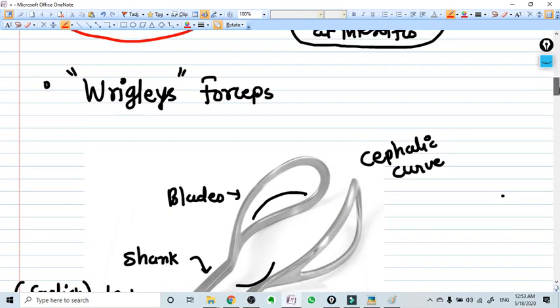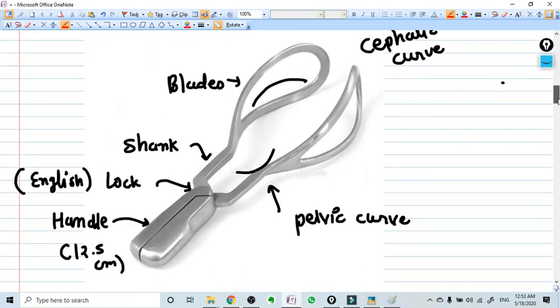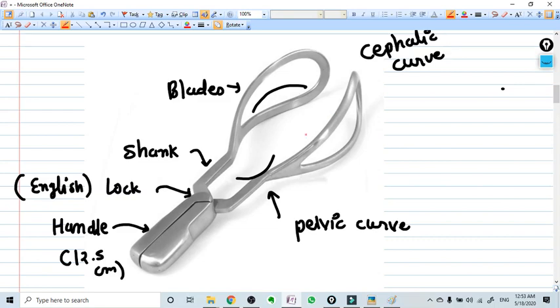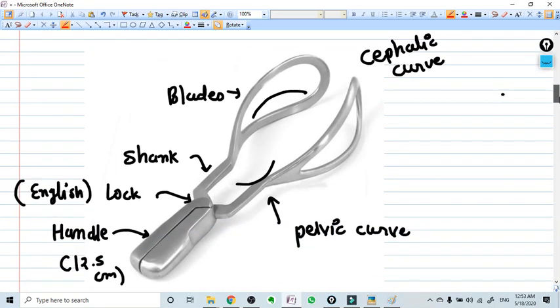Wrigley's forceps are the only forceps that is used in India nowadays. This is the Wrigley forceps. You need to identify the parts of the forceps for your practical exam purpose. For example, these are the two blades of the forceps, right and left blades. This is the cephalic curve. Why is it cephalic curve? Because it holds the cephalum, that is the head of the baby. This is the pelvic curve.